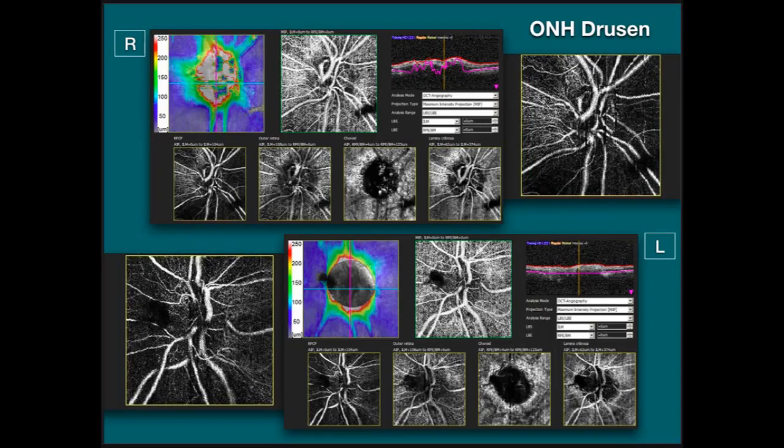As we knew from the clinical photograph, a lot of the drusen were located nasal on the disc, and you can see the capillaries are basically all gone in that area. Inferiorly, they're all gone as well, but relatively spared temporally and a little bit superior temporally in that eye. Let's compare it to the left eye. Again, we can see in the enlarged image of the inner retinal layers that there's significant capillary dropout right around the disc. You'll also notice that the deeper layers are relatively spared in both eyes. So the capillaries and vasculature in the deeper layers down at the RPE choroid and lamina cribrosa level are relatively unaffected. It seems to be the drusen that are more superficial that have damaged the blood supply and damaged the axons.